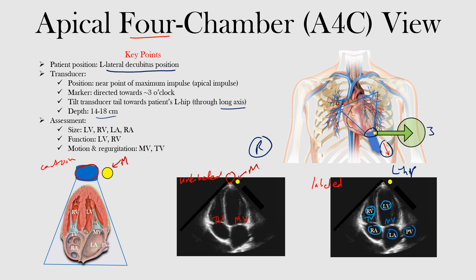We can assess, as the name implies, the four chambers: the size of the left atrium, right atrium, left ventricle, and right ventricle. We can also look at valve motion and whether there's any evidence of regurgitation at the mitral valve and the tricuspid valve between their respective chambers. We also want to note the pulmonary valve, which you may sometimes be able to catch on this view as well.